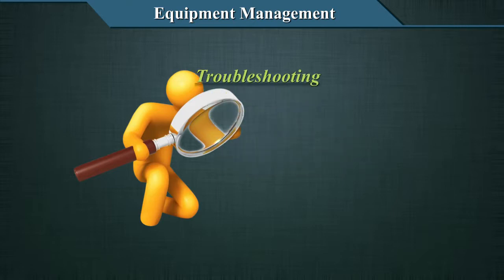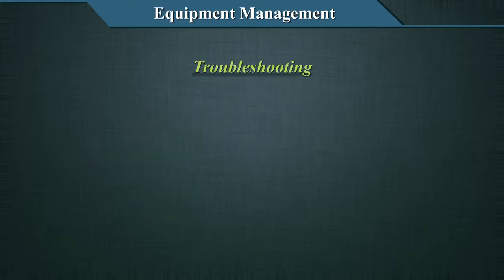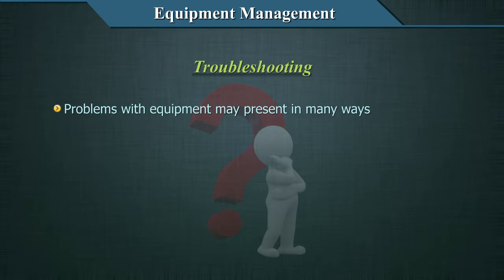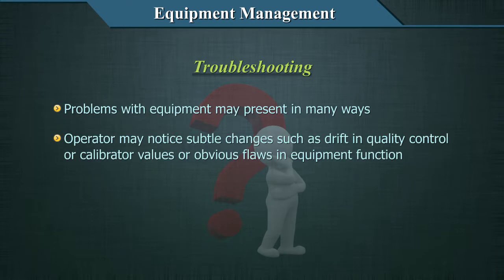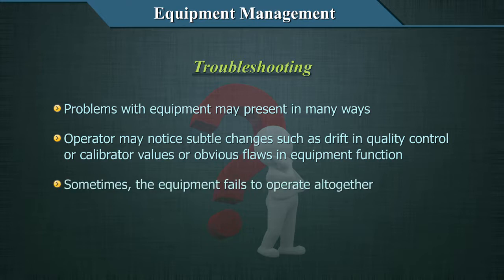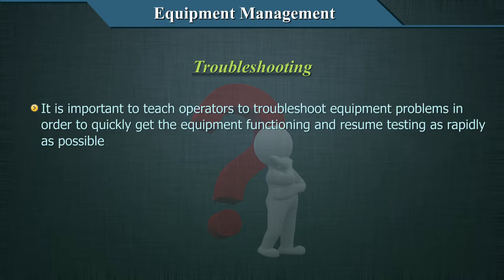This is a very important concept in equipment management. Problems with equipment may present in many ways. The operator may notice subtle changes such as drift in quality control or calibrator values, or obvious flaws in the equipment function. Sometimes the equipment fails to operate altogether. It is important to teach operators to troubleshoot equipment problems in order to quickly get the equipment functioning and resume testing as rapidly as possible.